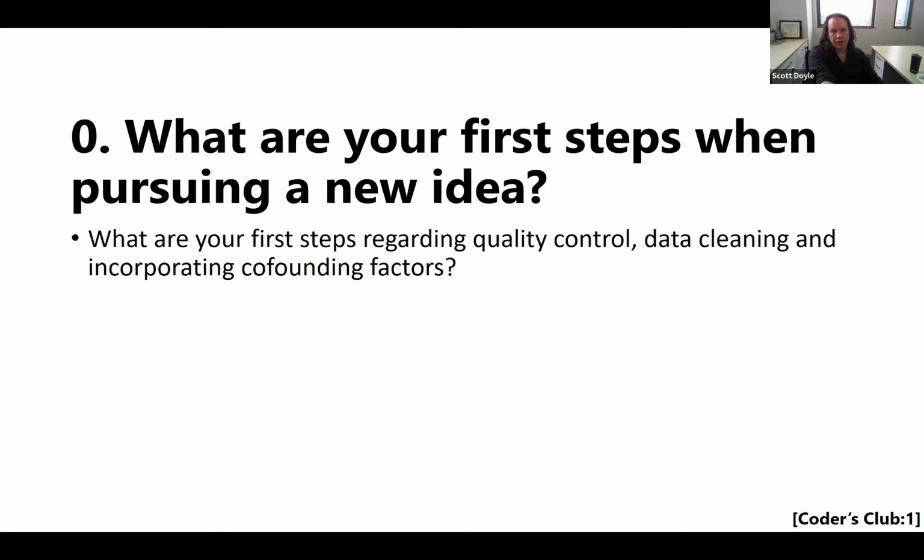Cool. One other thing I will do with early projects is what they do a lot in regular software development and industry software development, which is iterate as soon as you can. One of the things that we tend to do is we take a model, train it just a little bit, run it on a large section of data, and let the algorithm tell us what it struggles with and what kind of sources of noise we might get.